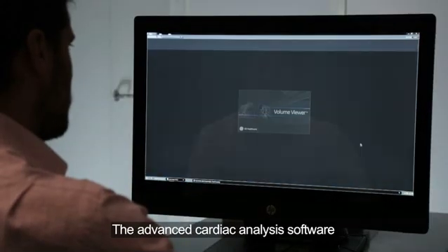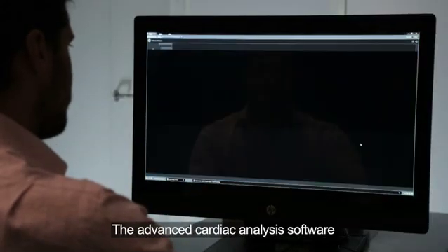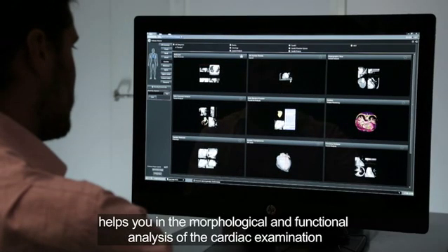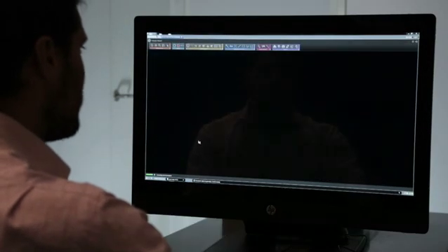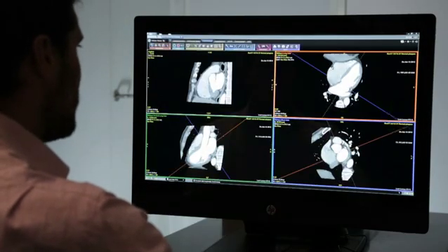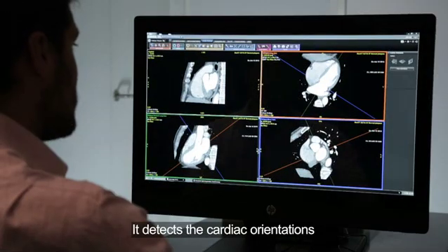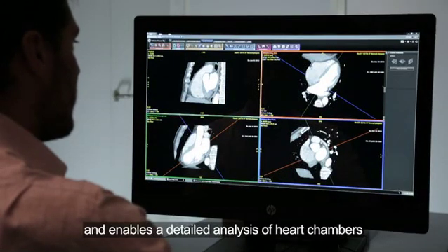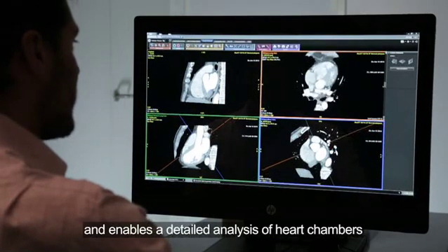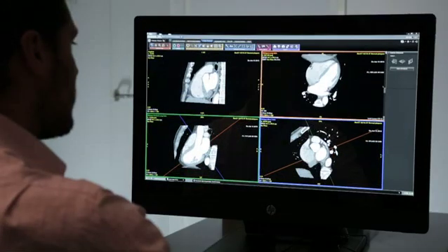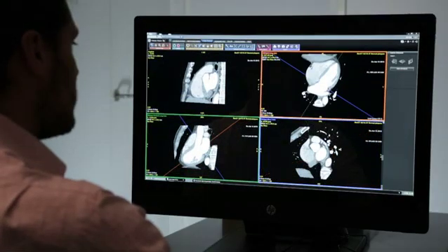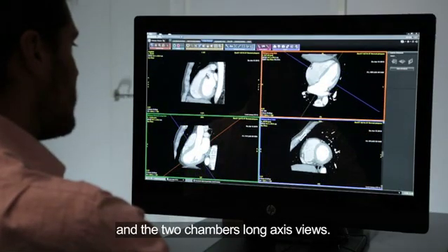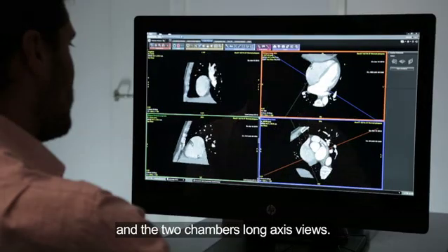The advanced cardiac analysis software helps in the morphological and functional analysis of the cardiac examination. It detects cardiac orientations and enables a detailed analysis of heart chambers, such as the long and short axis views and the two-chamber long axis views.